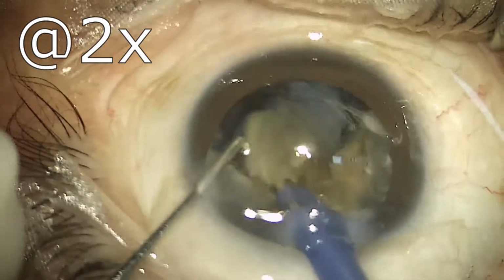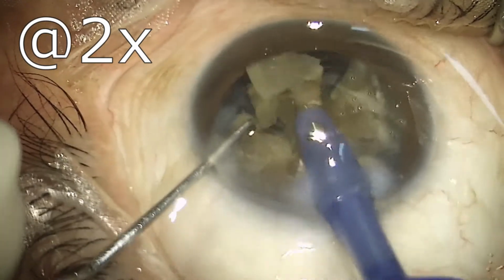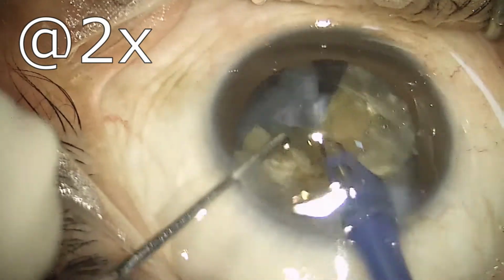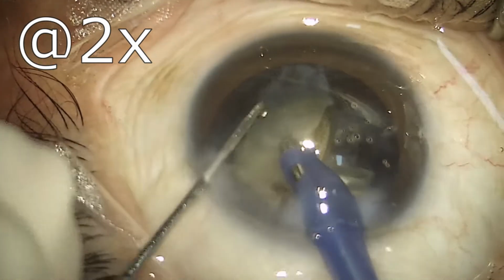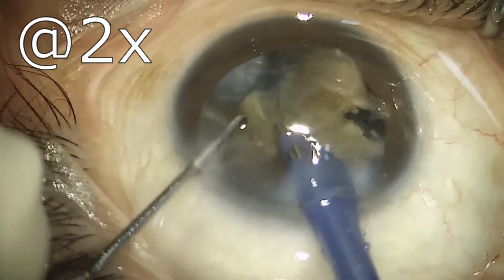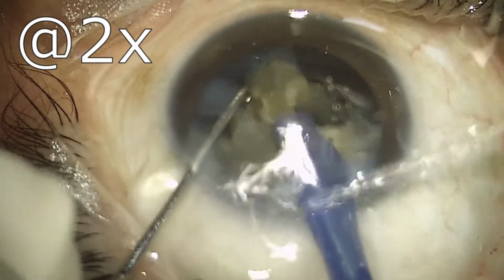If the posterior limit of the nuclear elements is properly separated, then these pieces can simply be pulled out for emulsification. The emulsification is being done at the pupillary plane, as these capsules are not very elastic and very fragile, so every care should be taken not to stretch the capsular bag too much.